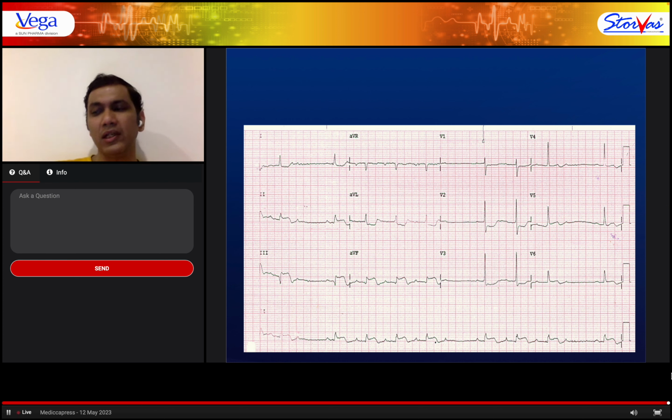One of the key features that helps us discuss this is the presence of a narrow QRS complex as opposed to a wide QRS complex. So the block is likely to be within the AV node and therefore likely to also have a contribution from the vagal tone.